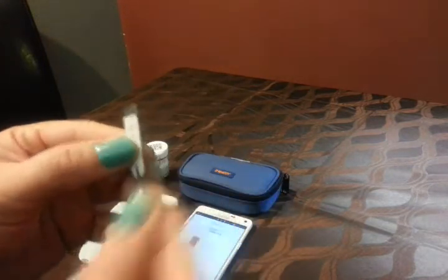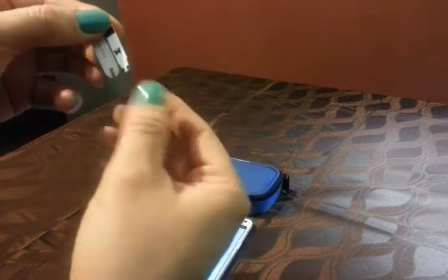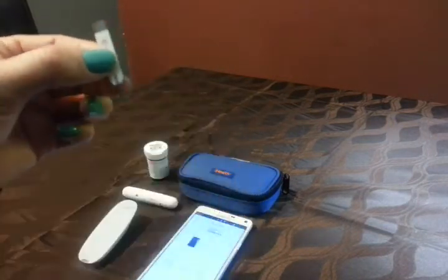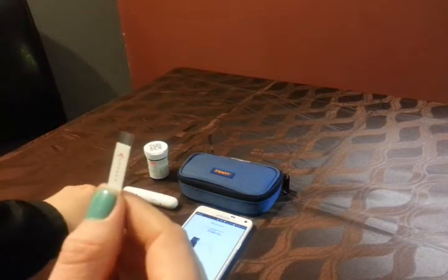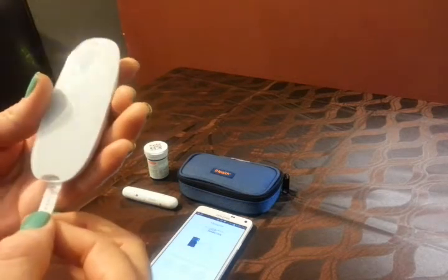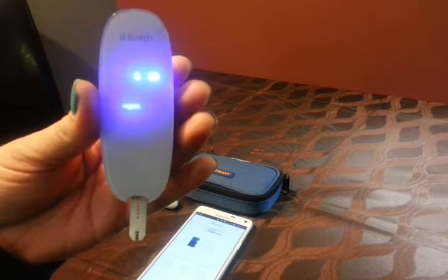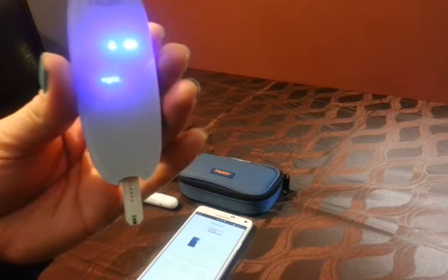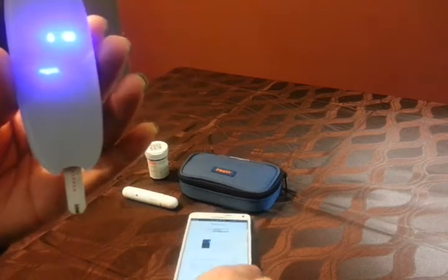There's my test strip. Remember how much larger it is than my Freestyle. We'll go ahead and test on both meters also to make sure they match and see how close it is. It's so space-aged. You can check your blood glucose on just this, but I have it synced with the phone, so it's going to pair shortly.